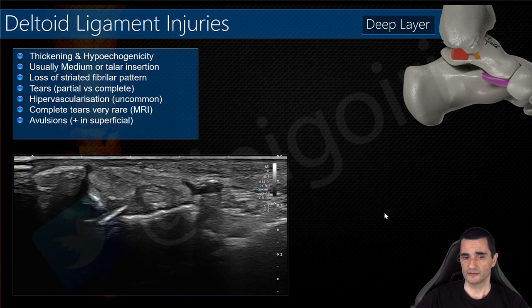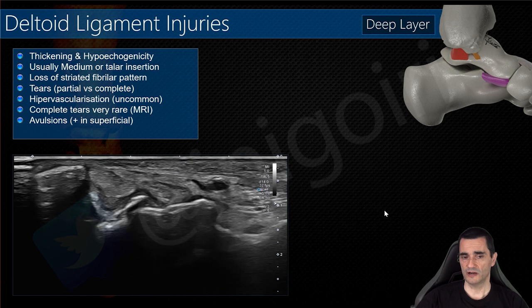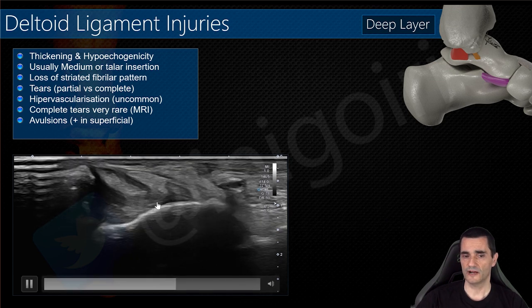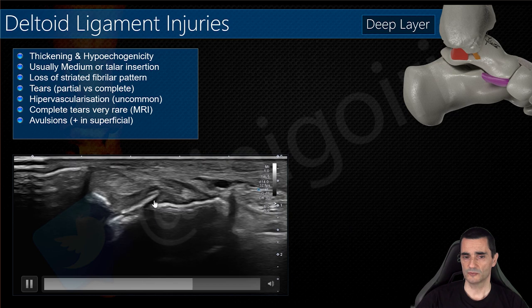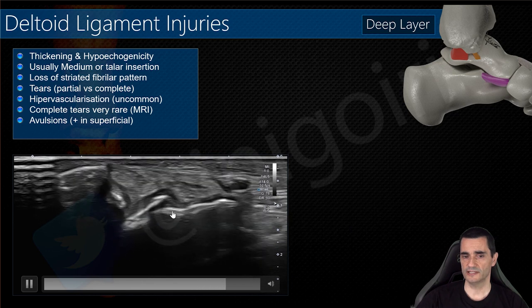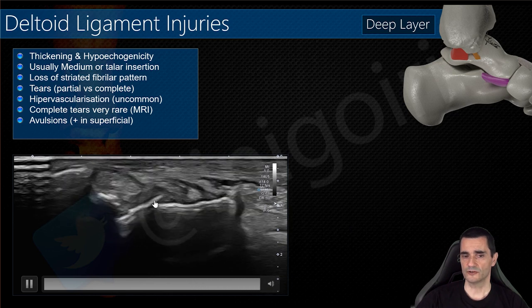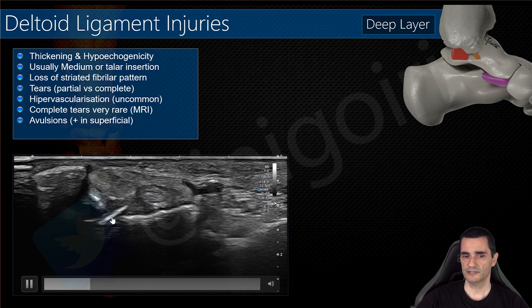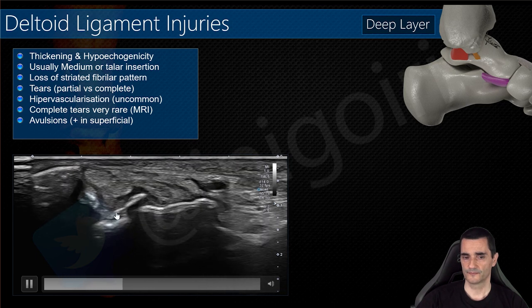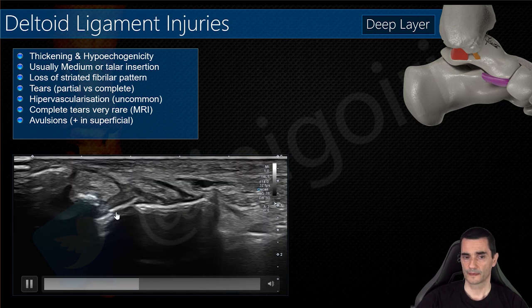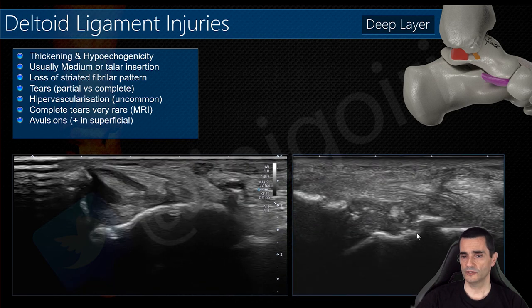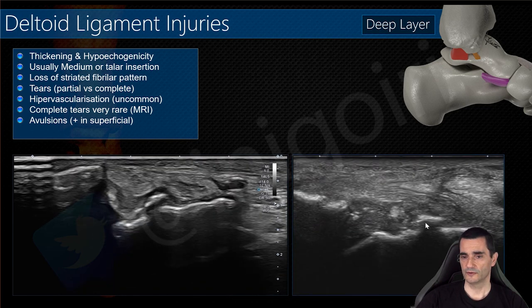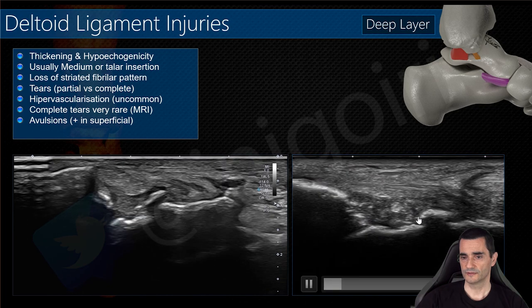Avulsions may be present. They are most frequent in the superficial component, but you can also find avulsions in the deep component. This is an avulsion of the insertion of the posterior tibiotalar ligament at the talus, and this is an avulsion of the anterior tibiotalar component at the talus.